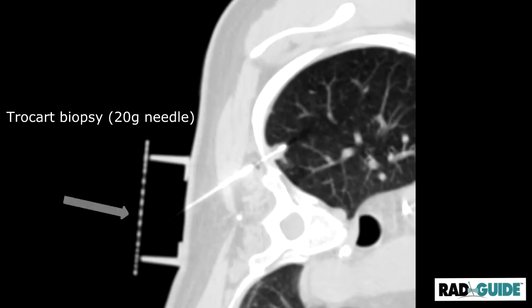Finally, the top plate was placed in its original position, supporting the guiding needle, and the trocar needle was inserted, and the biopsy of the nodule performed. In this clinical case, the biopsy could confirm that the nodule was benign and the patient could be considered an organ donor.